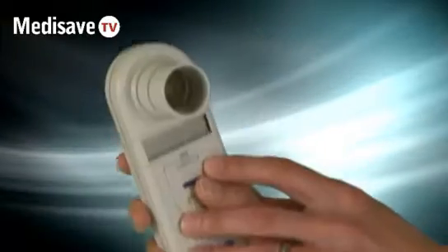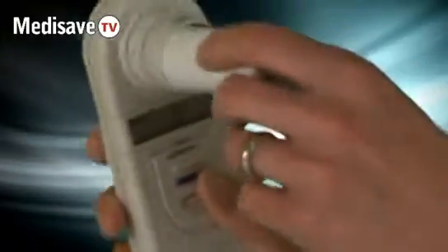It's very simple to use. You simply switch up to blow, insert the mouthpiece. I'll just do a quick test.